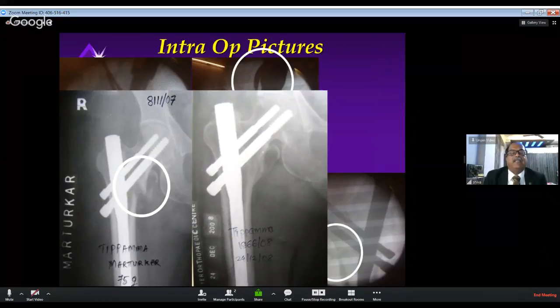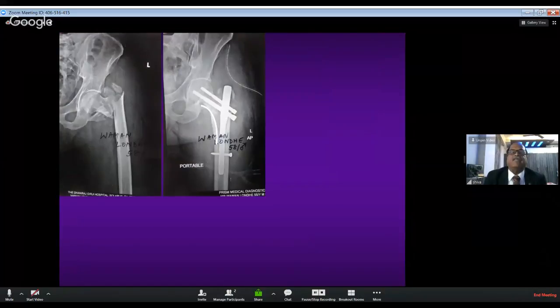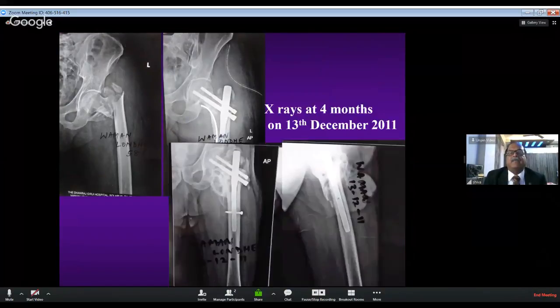So in this case of 2007, you can see the neck or the beak of the neck is much more medial than the shaft. There is a gap of almost 5 millimeters between them, but there is a neck shaft angle or the valgus angle, which is always very, very useful for the fracture to unite. In the same case which I have shown earlier, this is immediate post-op X-ray, and subsequently at about 4 months time, you can see the beautiful consolidation around the implant in such a badly comminuted fracture.